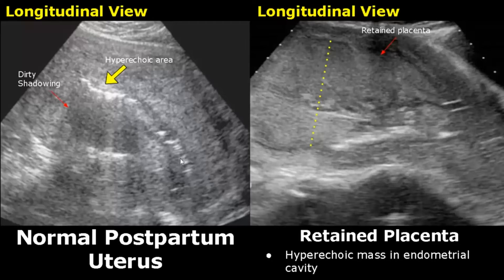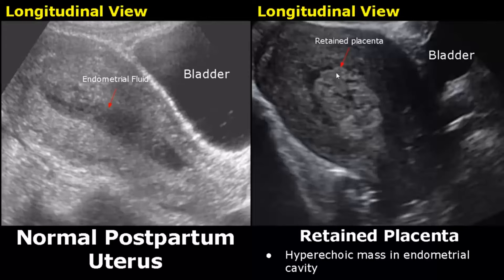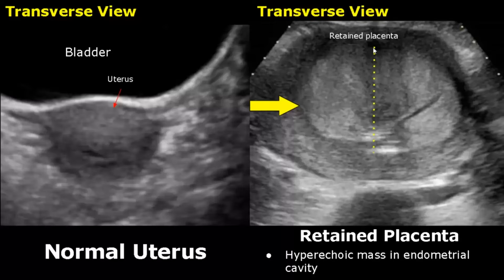This image is compared with the normal postpartum appearance of the uterus. Here is another image of a retained placenta: a hyperechoic mass in the endometrial canal with the patient suffering from fever, pelvic pain, and abnormal bleeding. In transverse view, we can see an enlarged uterus with a hyperechoic mass in the endometrial canal.